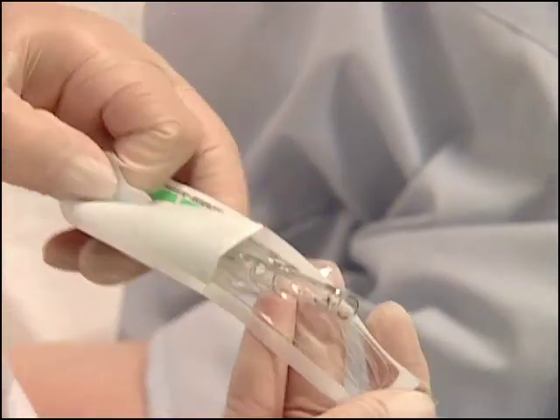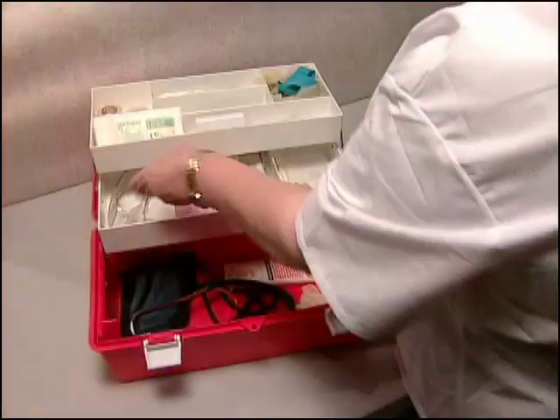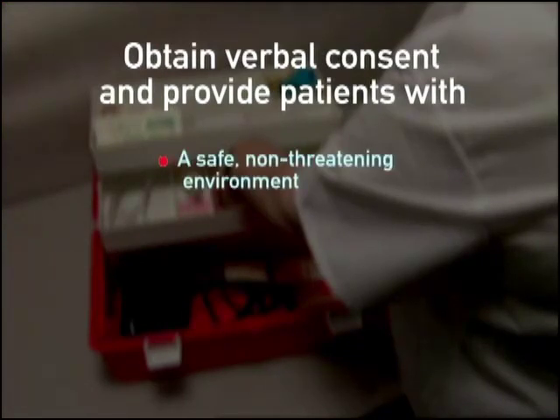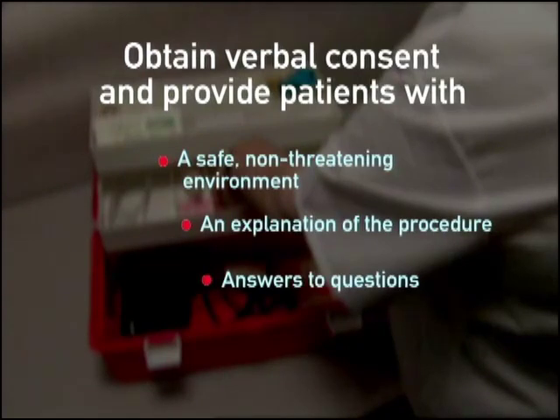Your goals are to create a safe, non-threatening environment and to gain consent for the procedure whenever possible. These goals can best be attained by explaining to your patients the reasons for the procedure and describing the steps needed to accomplish the task.